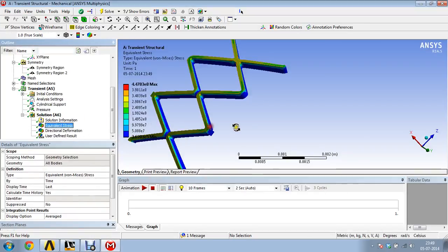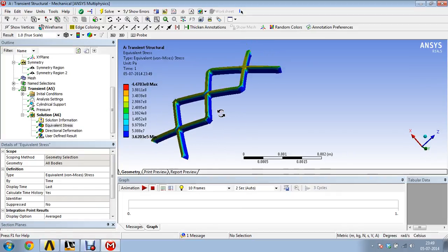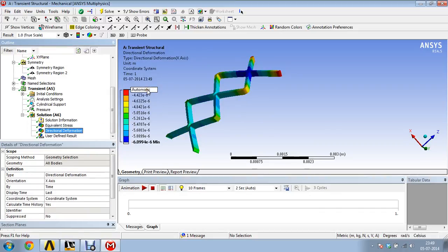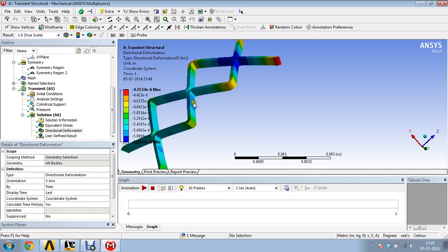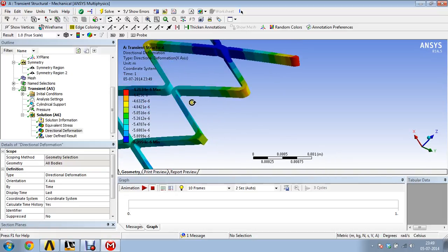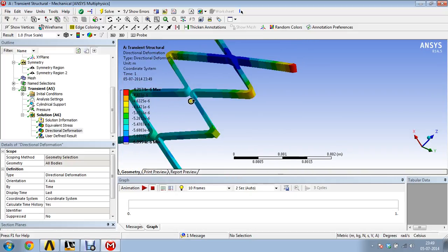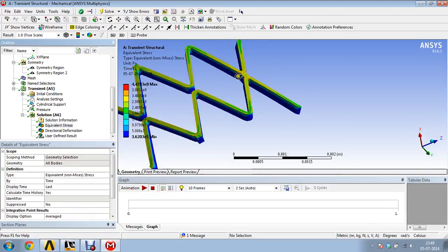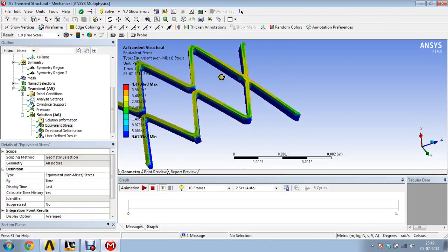We will see the equivalent stress. You can see the equivalent stress, and you can see the directional deformation. The directional deformation is very low in the direction of the x-axis for this coordinate system, and we can see that the directional deformation is around micrometers. It's quite natural, because in the previous result we had given a displacement of around 1 mm, so there were huge stresses. Now they are not huge stresses, and they are around the yield strength of structural steel.